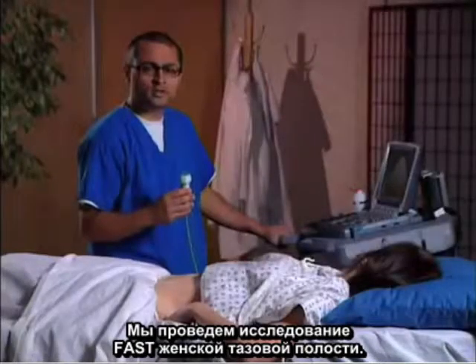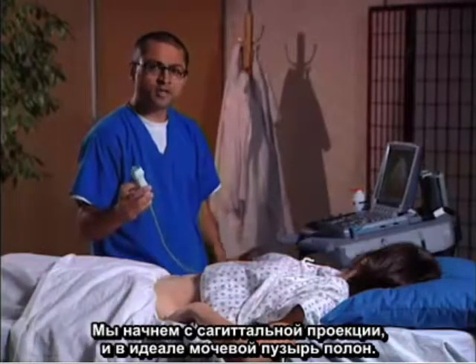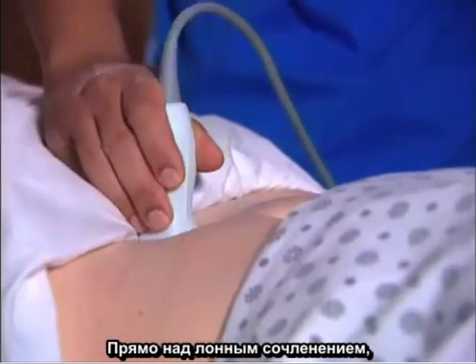We're going to do the FAST exam, the pelvic view in a female now. Again, we have the phased array transducer. Here's a probe marker right here. We're going to start off with a sagittal view, and ideally the bladder is full. So we go just above the symphysis pubis.